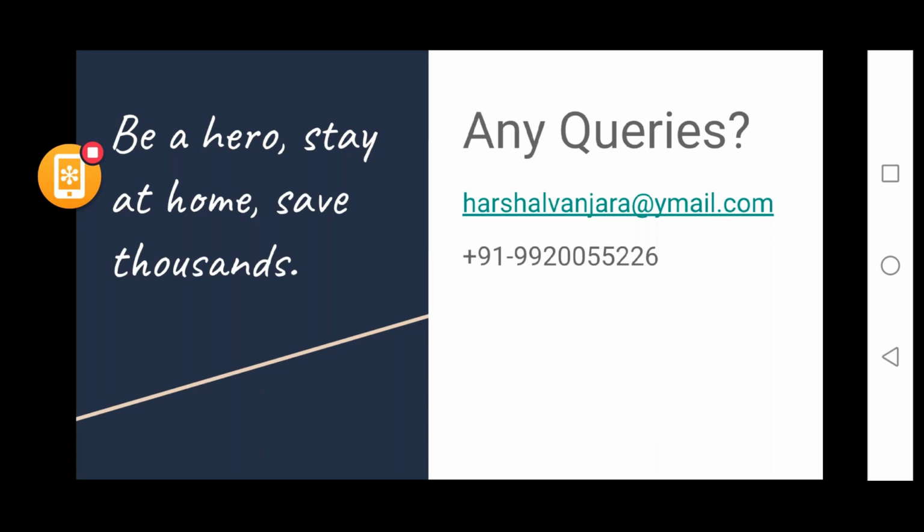His question is: when is cycloplegic refraction required in the case of myopia or otherwise before refractive surgery, for the aberrometry findings? Please shed some light on it, sir. Okay, I'll just read the question. Just one moment. Yes, if you see aberrometry findings.